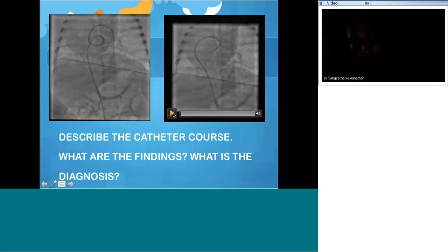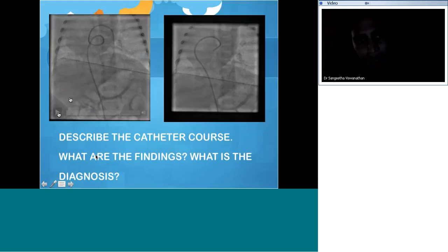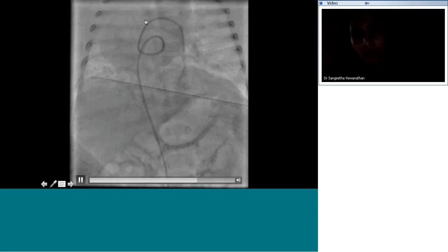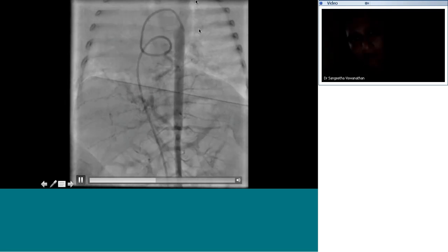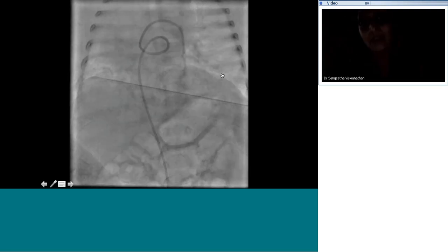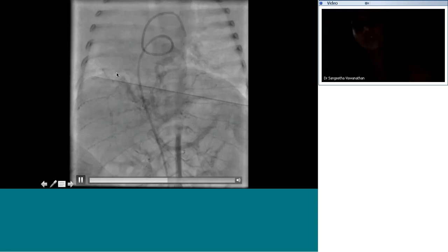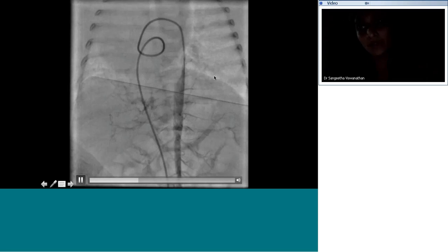Just put that on again. No, not what I wanted to show you. So I think we have gone LV into the aorta, but I think this heart is not a very normal heart. So the position of all the structures is a little off. But I think the important thing is when you see the cardiac silhouette pulled across to the right, it's important to remember scimitar syndrome and look for it.